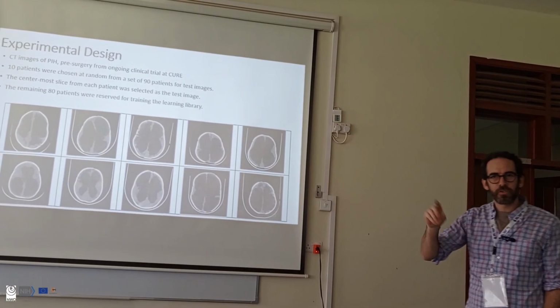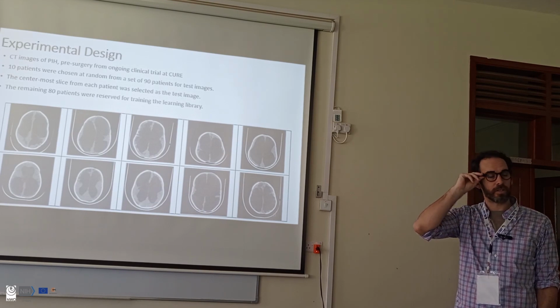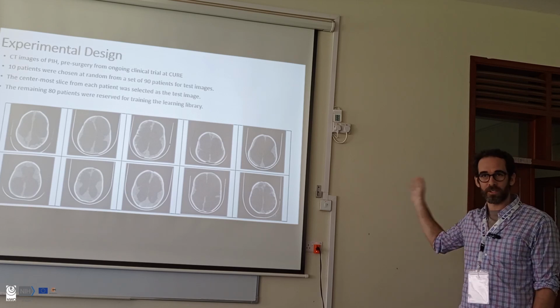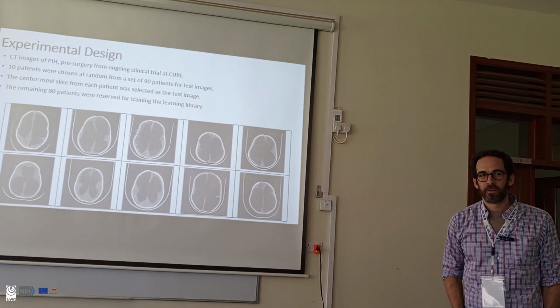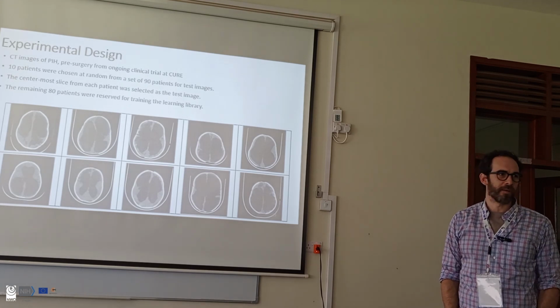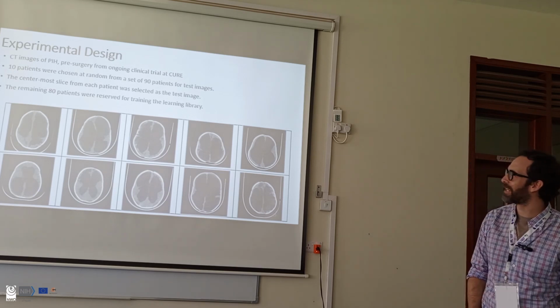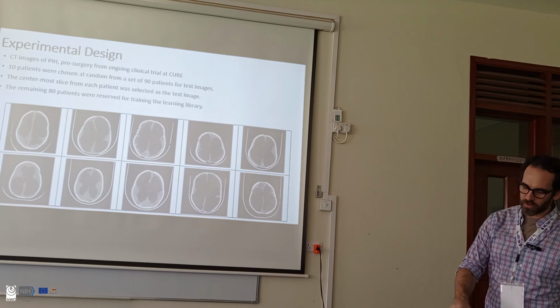And I took the centermost slice from each patient to use for this, because I'm going to show these to some surgeons, and using all of the slices would have taken a couple of days of the surgeon's time, and surgeons don't have that time. So we had to reduce the amount of time a little bit for these guys. So this was the way we set it up.